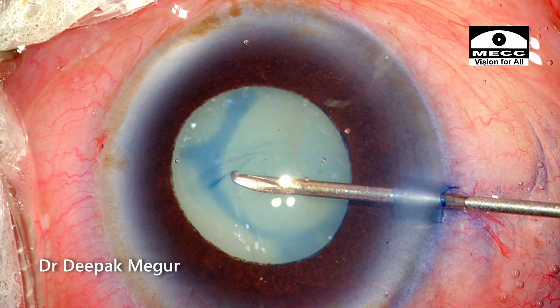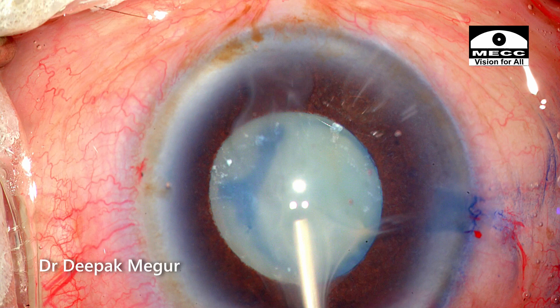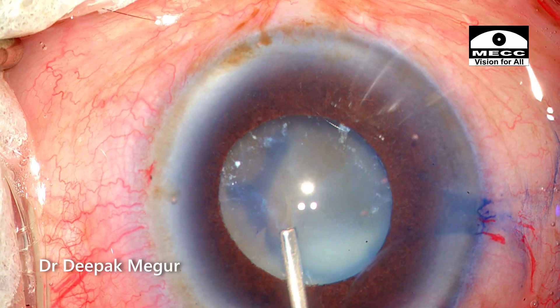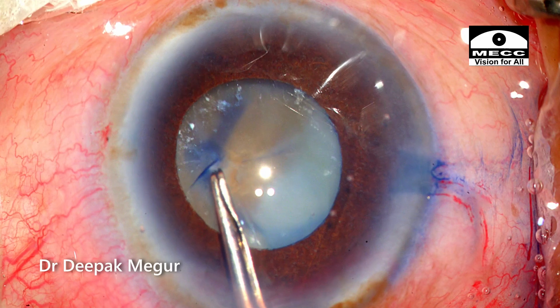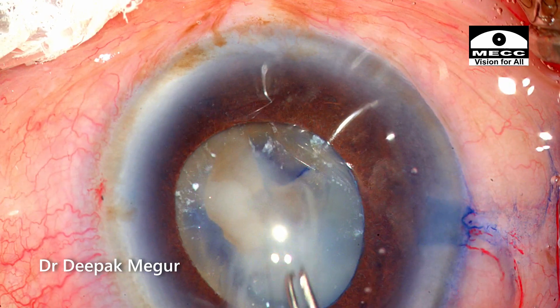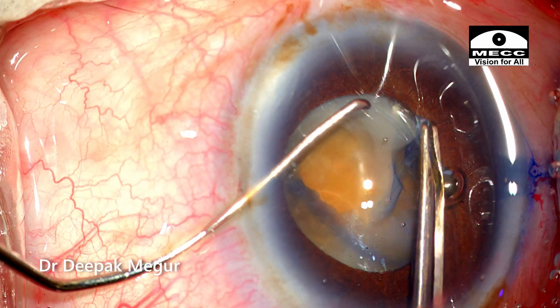As soon as it is punctured, the fluid cortex escapes out. Gentle irrigation in the bag with BSS ensures that the fluid cortex is irrigated out to improve visualization. OVD is again injected and the rhexis is continued. The cortex comes out again, forcing me to stop and then re-inject OVD.